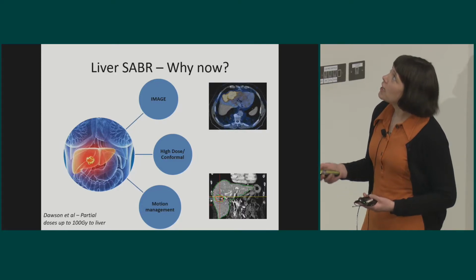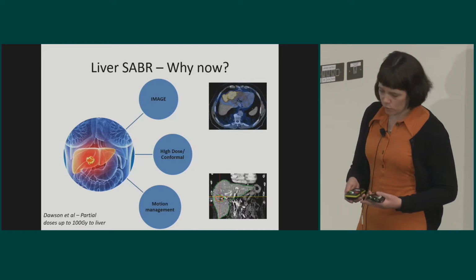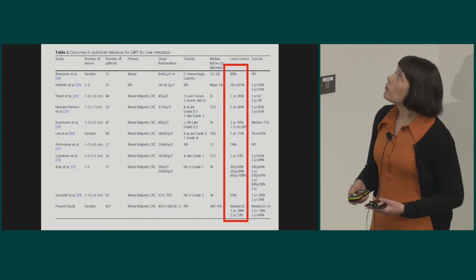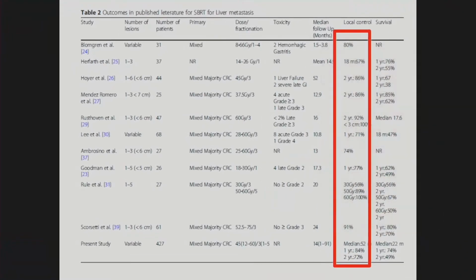So you need to image, treat very conformally, and we need to do some sort of motion management on these tumours. And this slide shows that you can get quite good local control with this type of treatment if you can give quite high BEDs.